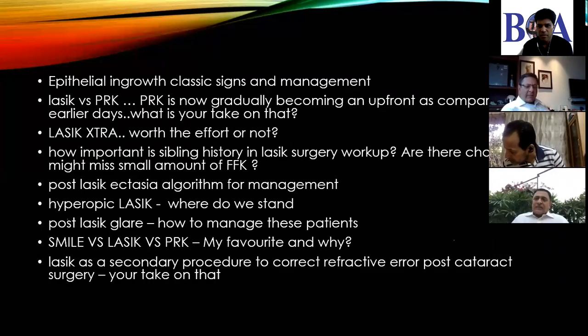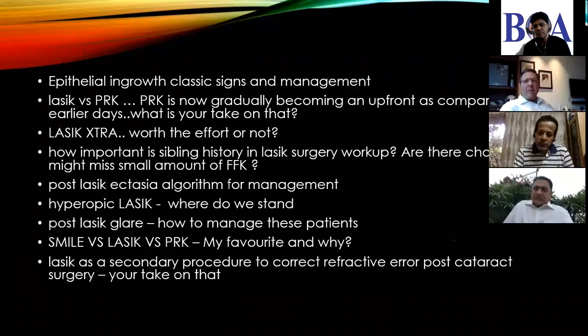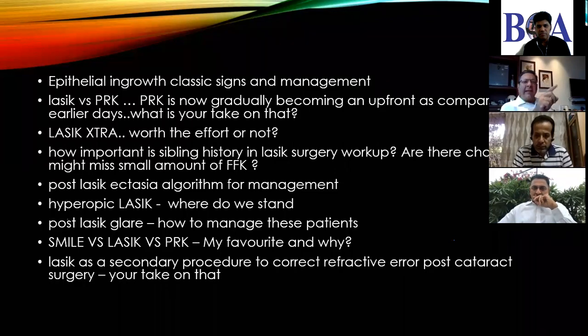Epithelial ingrowth you will see close to 8 weeks or so after the surgery as very evident. Before that, you may see what I call tide marks, like a receding tide around the margin of the flap. Now, that could occur if your keratome is not working too well, and in the days gone by when people would reuse blades. Those days, I think, are long past us. So if we see an ingrowth, it will be sort of mid post-op, in months rather than days or weeks.